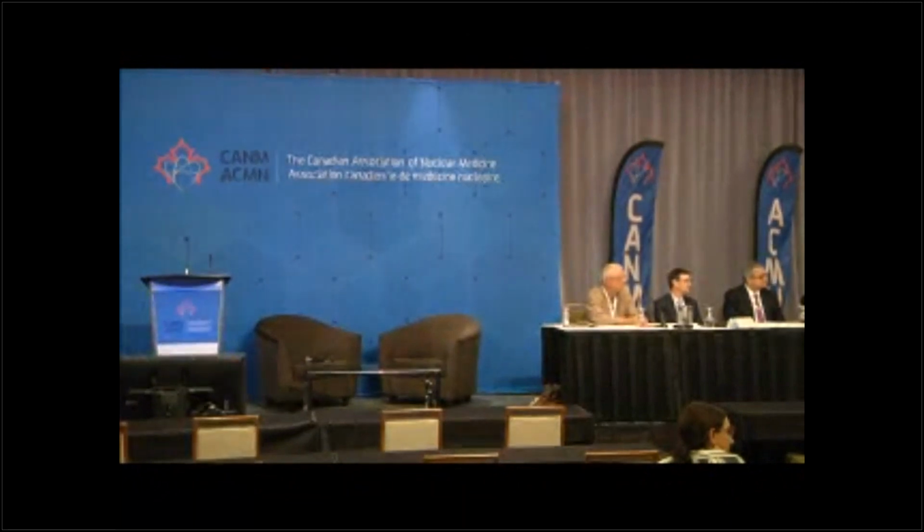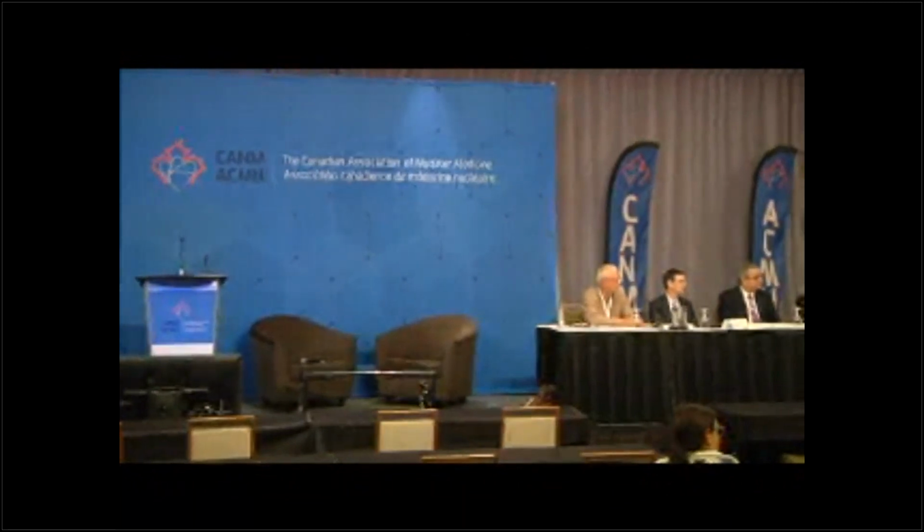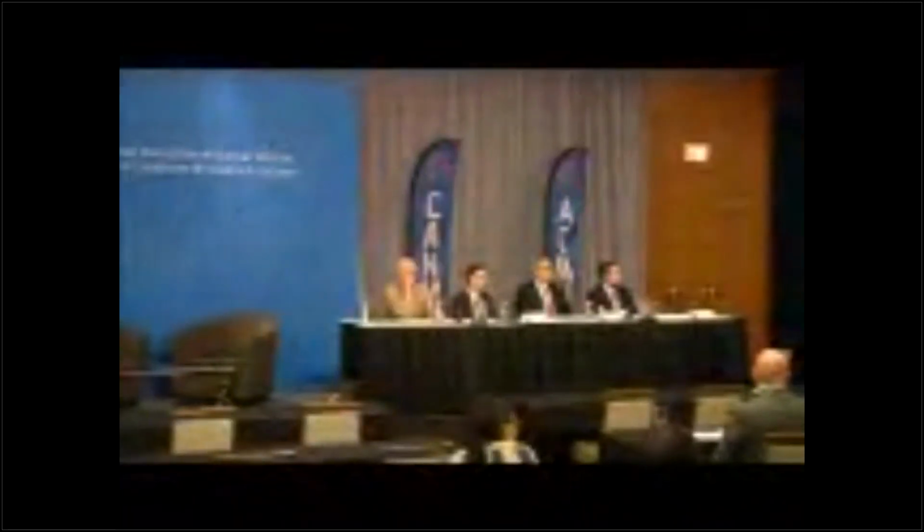It can be a challenge with infection imaging in diabetics, in terms of preparation, holding insulin, holding diet. The infection itself can create hyperglycemia in diabetic patients. So I'm just wondering, do you think white cell imaging may be preferable in diabetic patients over FDG PET? In which clinical context? Well, for cardiac infection. Okay.